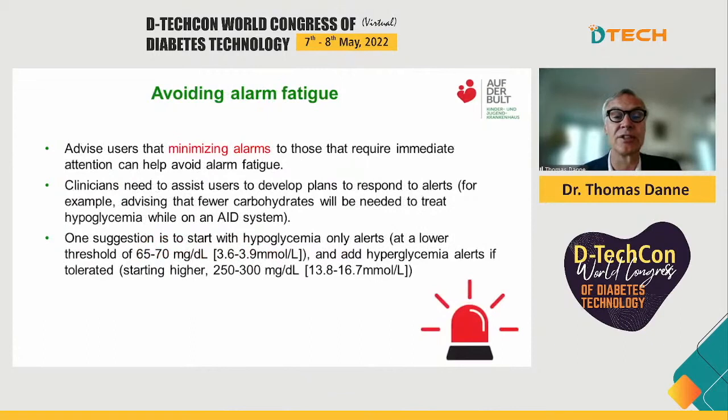The last issue here is the idea of alarm fatigue. So make sure that whenever a patient is experiencing many alarms, you are very careful with the alarms, and only keep those alarms that are really necessary for safety, so that the patient does not have too many alarms.